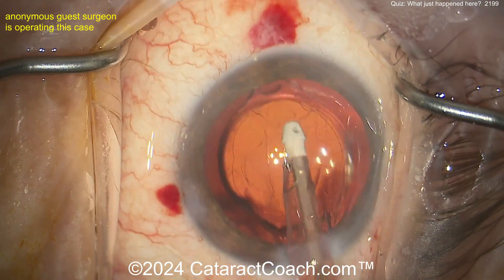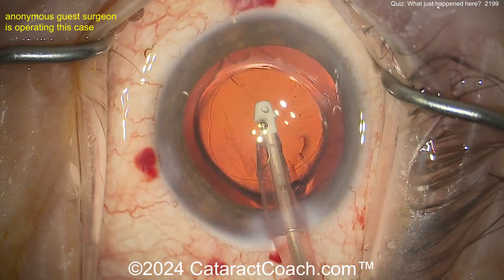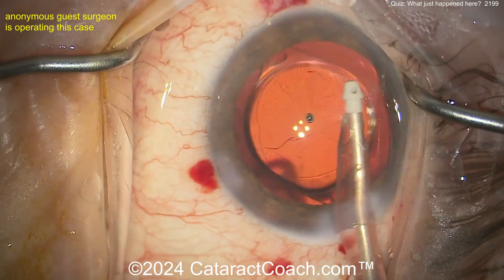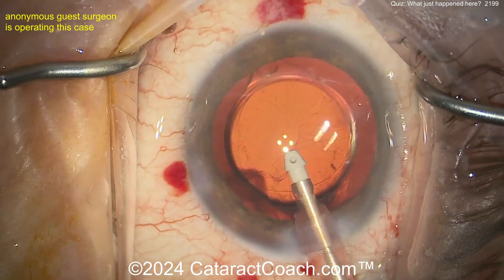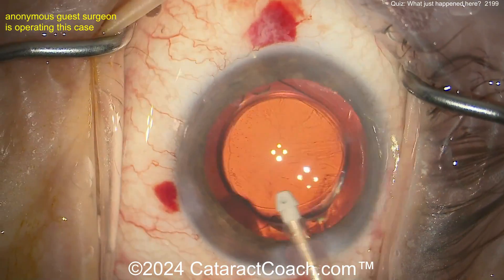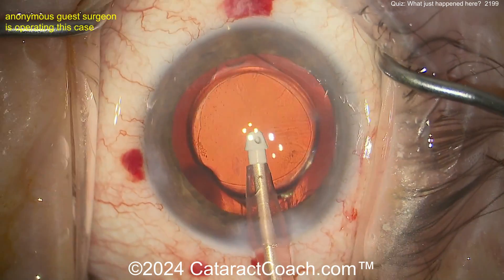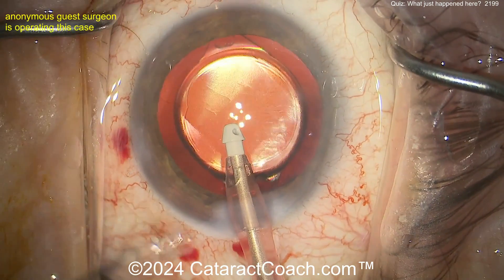That capsule equator is being bolstered or supported by the outward force of that haptic. But look — if you rotate that IOL 90 degrees, you would not have that benefit. So make sure you keep the IOL haptic pressed up against that area. If you have zonular loss for a clock hour or two, get your lens in the bag with the haptic aimed at that area so it acts as a bolster for the capsule bag at the equator. You could still put a CTR in the eye, but I don't think it's necessary — it's not a whole lot of zonular loss, and this is not a progressive disease.